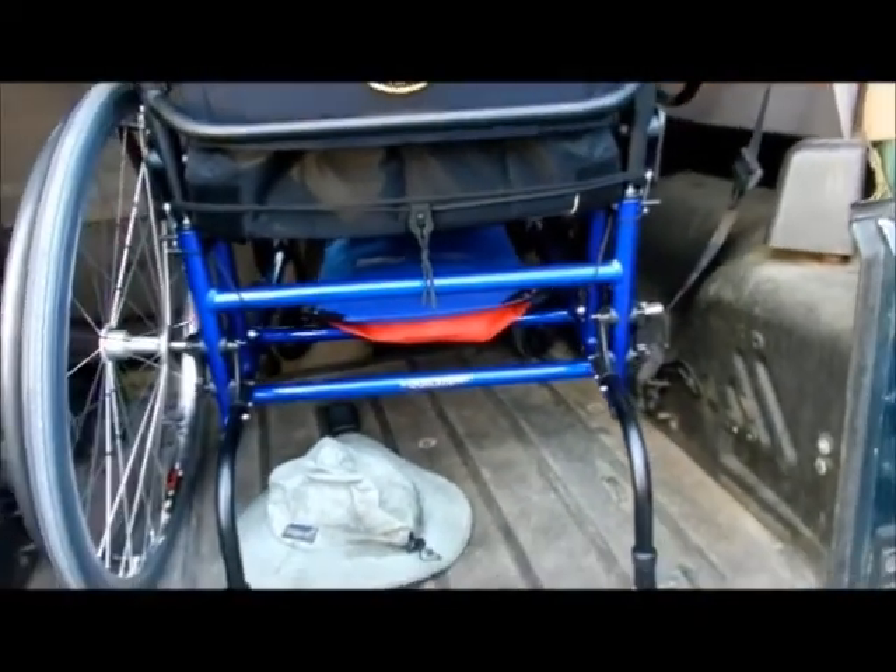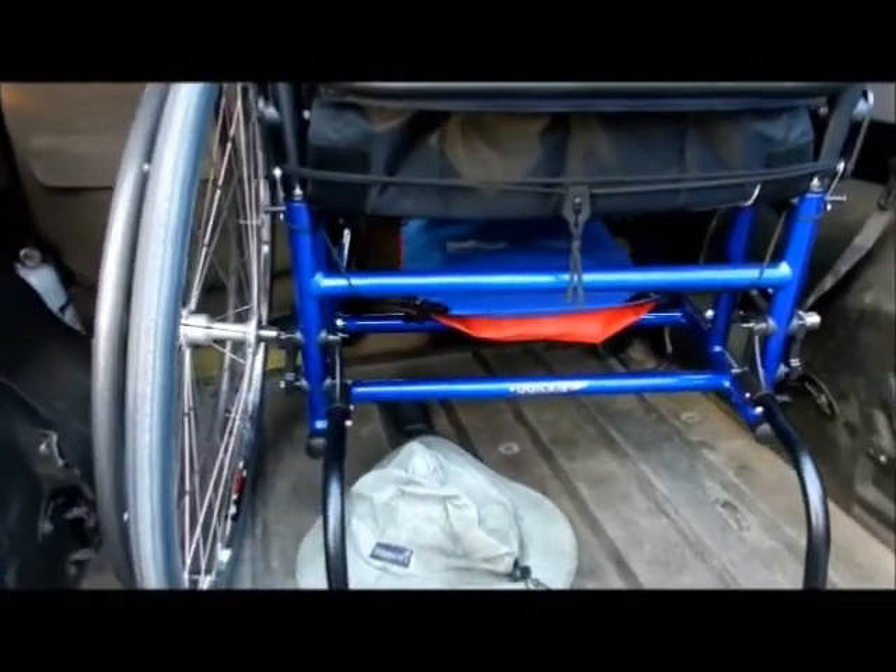Hello everybody. I already made a video introducing you to my new wheelchair, so I'm getting ready to do some work on it.